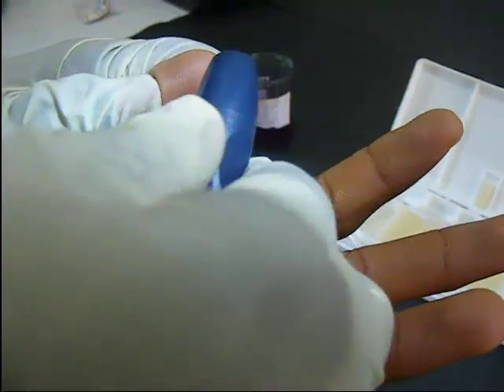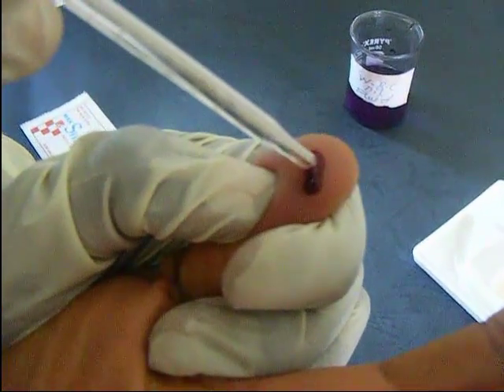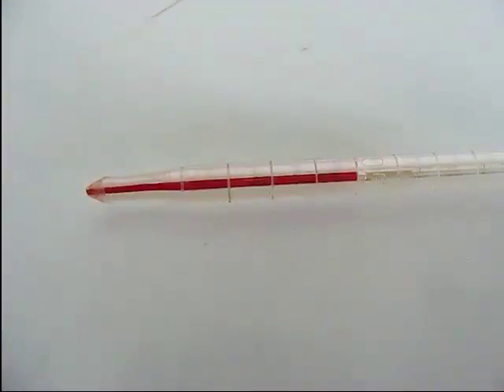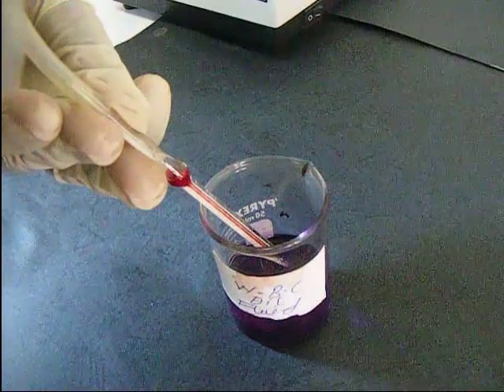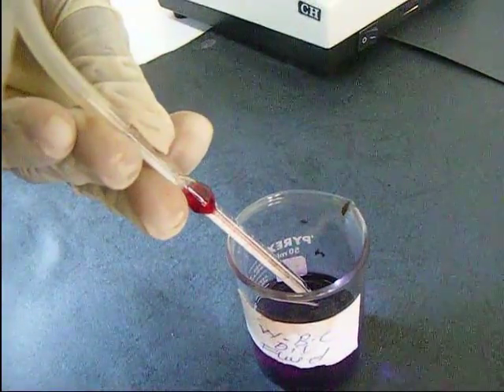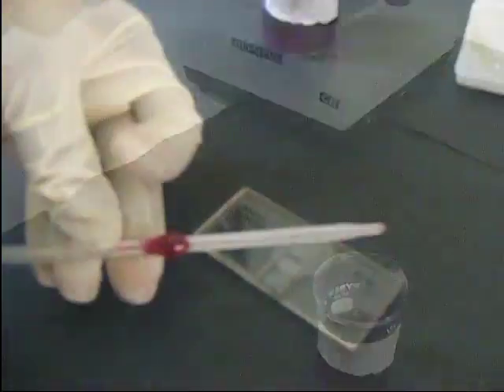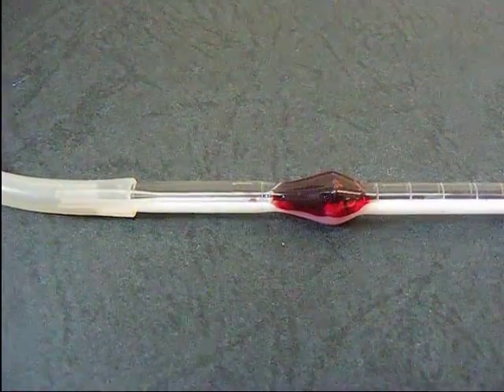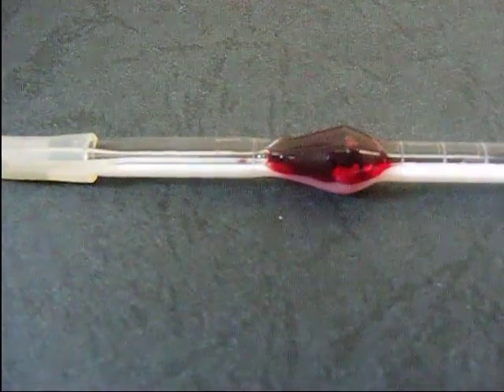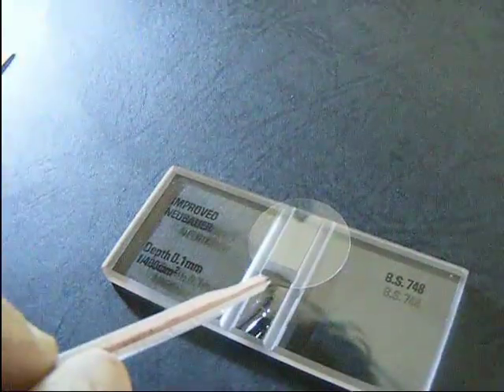The lancet is used to prick the tip of the thumb, and the blood is pipetted with a white blood cell pipette and brought to the 0.5 mark. The pipetted blood is then diluted with a white blood cell diluting fluid to the 11 mark. The counting chamber is then filled with the diluted blood.